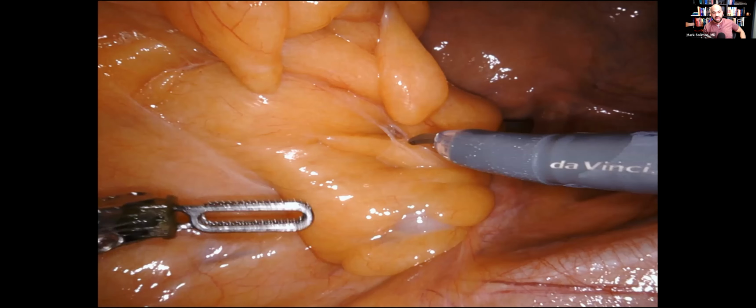And by the way, this is after all the lateral attachments have been taken. So sometimes you'll get in the OR and you've got diverticulitis, whatever, and the sigmoid colon is plastered to the left abdominal wall. I promise you, there are very few instances in which adhesions help you. Yes, I know that you may have an attending in residency talk to you about that. Yes, I know one of your chief residents at one time said, oh no, leave the adhesions in place, they're helping with retraction.